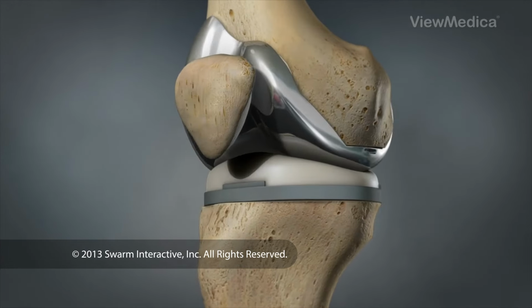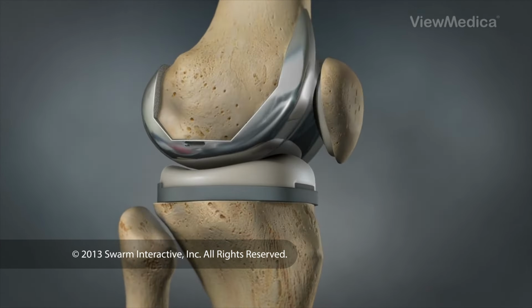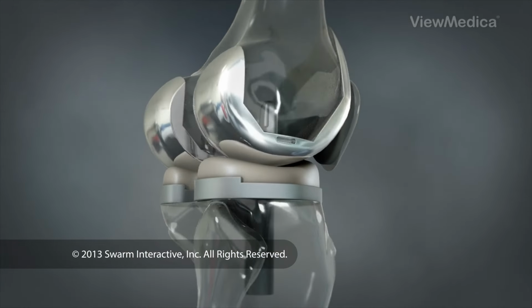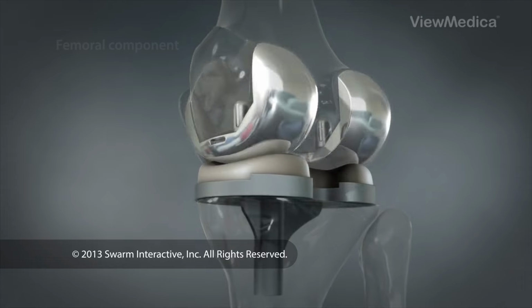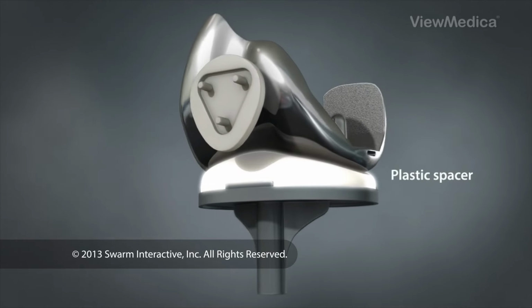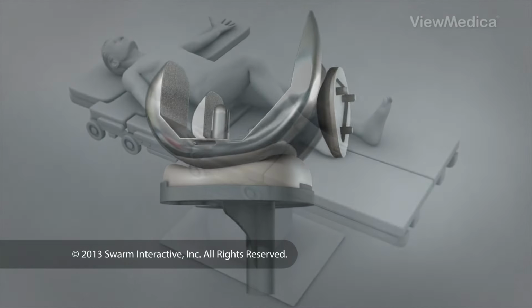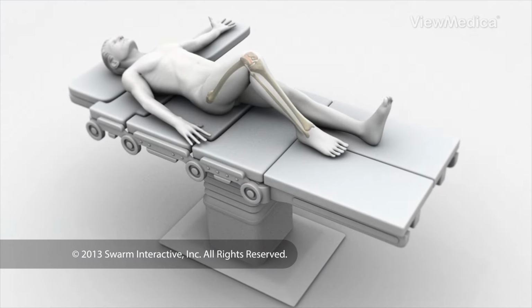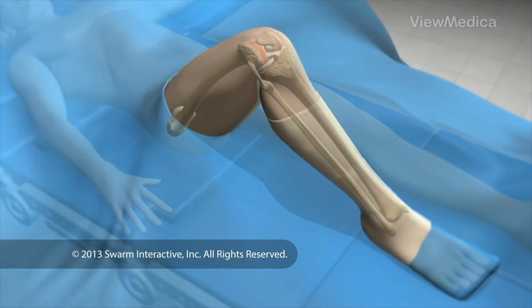During the procedure, the surgeon replaces the damaged portions of the knee with artificial parts. These parts consist of a metal femoral component, a metal tibial component, and a plastic spacer. A small plastic patellar component may also be used. In preparation for the procedure, anesthesia is administered and the patient is positioned.